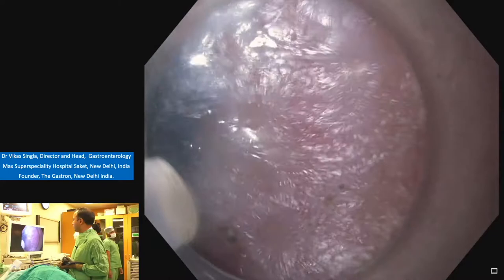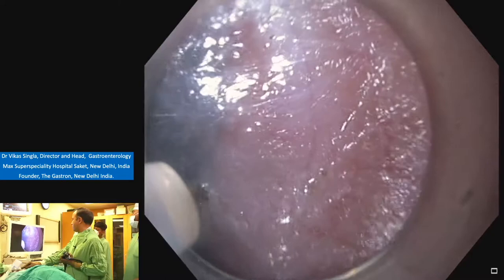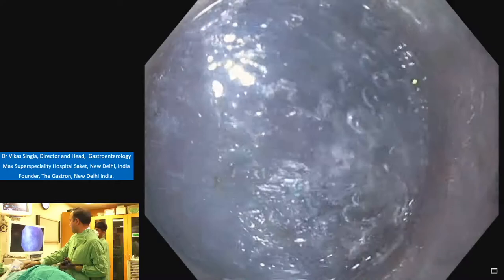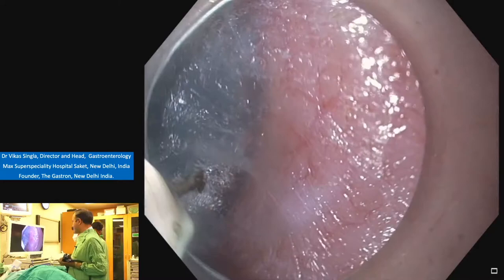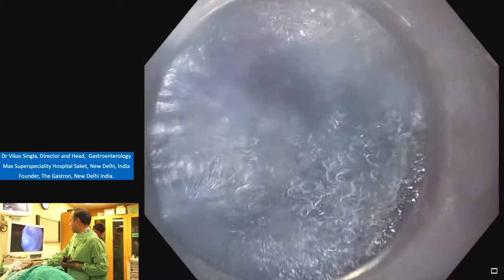I think we are midway through the tunnel, we are at 35 centimeters. Again we can see muscle on one side, mucosa on other side. So sometimes due to the smoke deposition on the lens, the vision becomes blurred, so we have to keep on cleaning the lens. There is very limited space for the smoke to escape. So that's why we have to keep on cleaning.